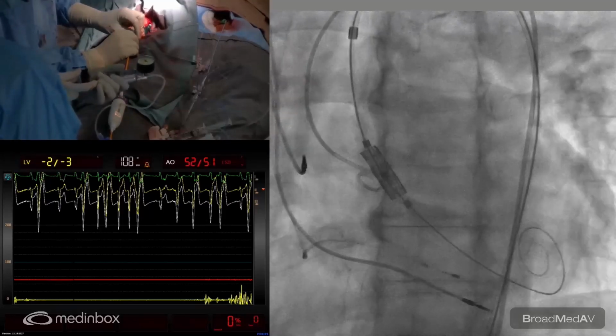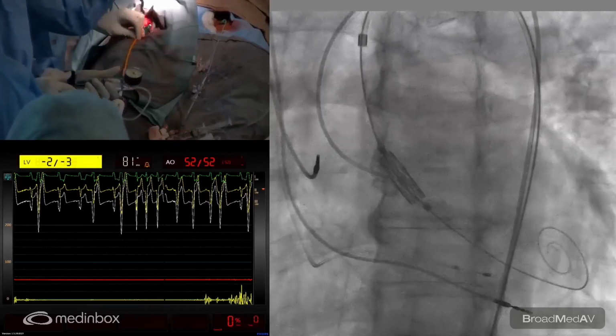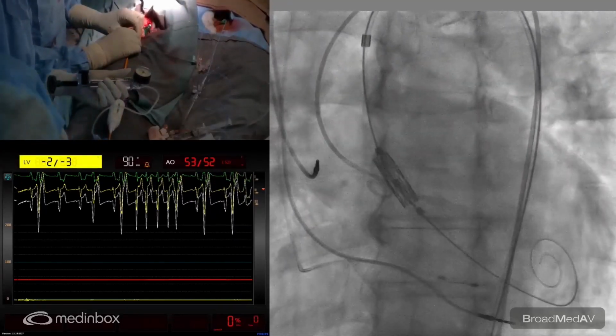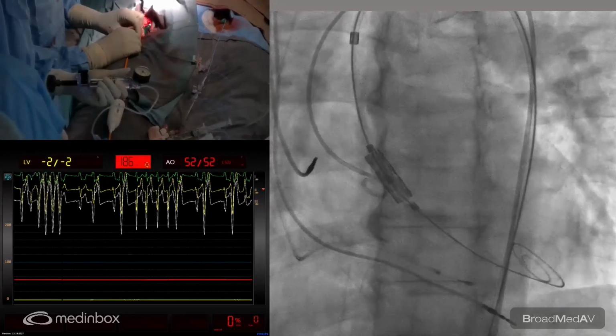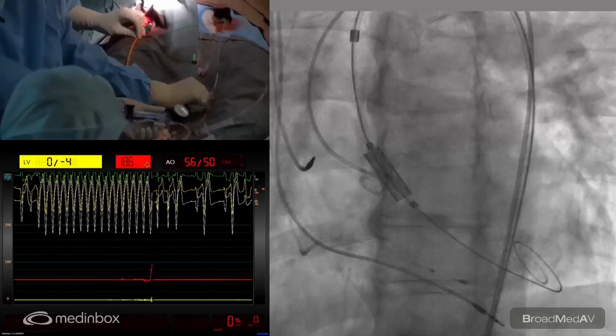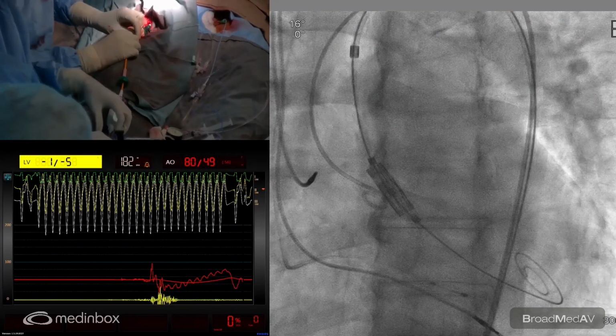And Nanda will do the dilatation. So I will take the pace. Call for pacing. So Ravi, please pace and watch the pressure, please. Should we go a little down? Yes. Sir, stop pacing. Sir, we'll go 1 millimeter down, sir.